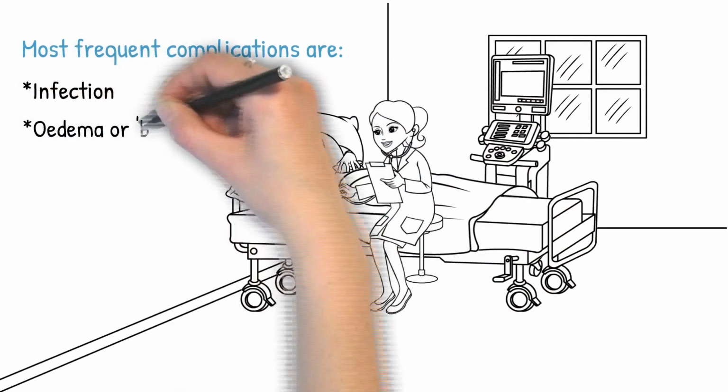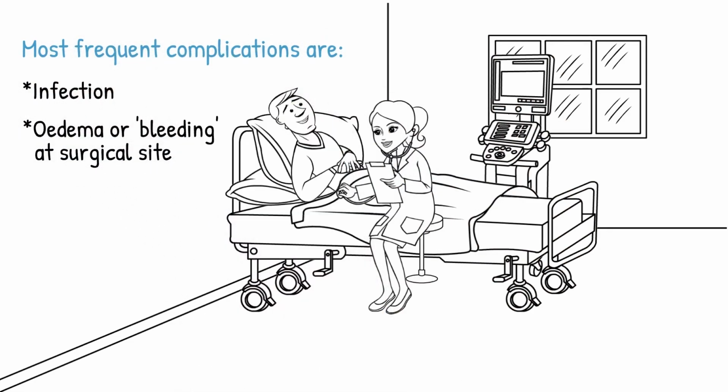The risk of edema or collection of blood inside the pouch. These are the most frequent risks associated with the ICD procedure.